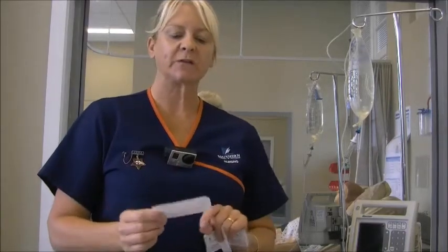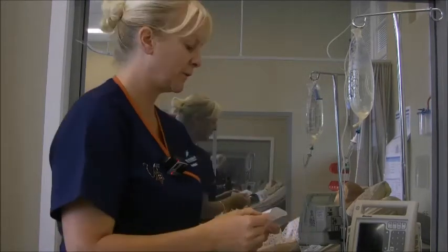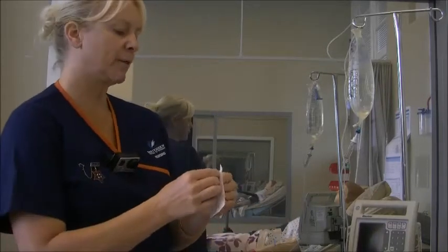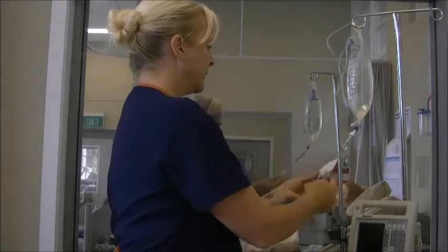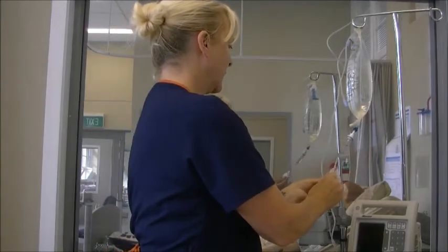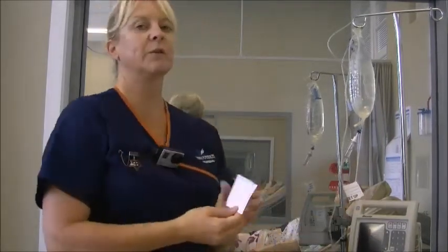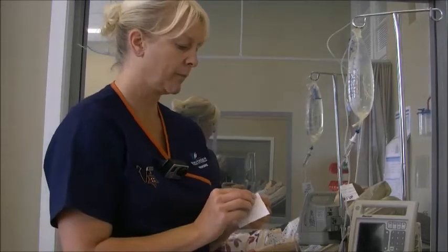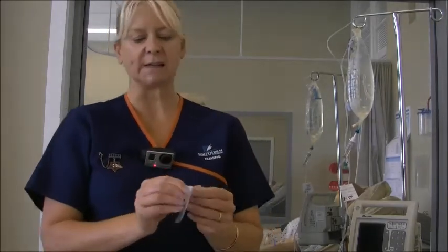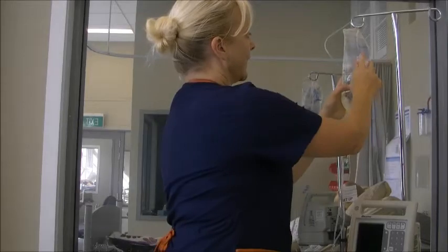Okay, the next thing that you want to make sure you've done is fill in the appropriate documentation. So putting the date and the time that you've signed that you're putting this tubing up. So what I do is just pop that up about there, so that I know when that tubing has gone up, and that I've filled in the correct information on here, and that's going up on the bag. It also needs to be checked by your RN, so make sure that they sign that with you. I'm doing this on my own today, so I haven't got a second checker, but I would always get that checked. I'm going to pop that up on the bag.